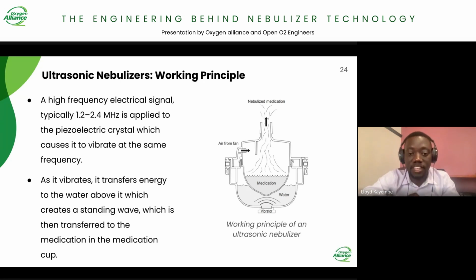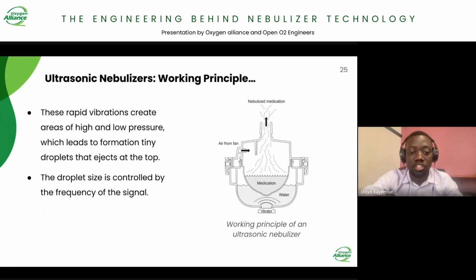As it vibrates, it transfers the energy to the water above the piezoelectric element. When this energy is being transferred to the water, it is then transferred to the medication itself. These vibrations that have been transferred into the medication create areas of high and low pressure within the liquid.